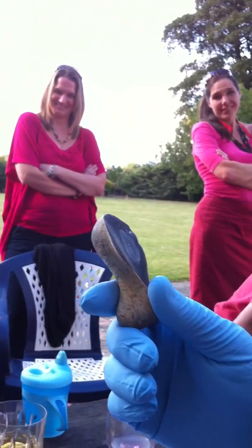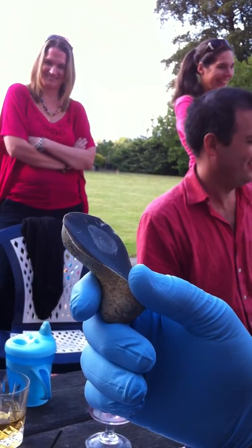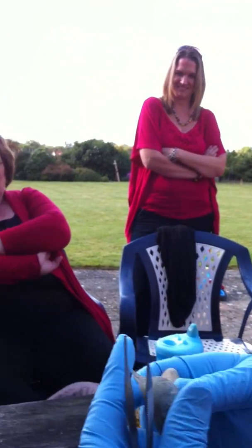Could the surgical and medical staff stop falling out, please? You're making me nervous. Okay, righty-ho. I think this is going to be the only operation on YouTube performed with Stone Age instruments. We may have to default to the scissors, but we'll give it a go first of all. I really am full of confidence.